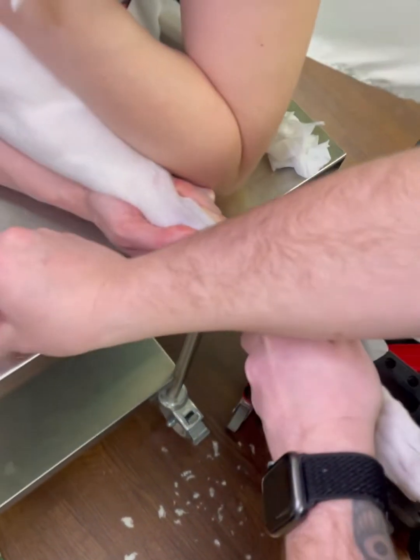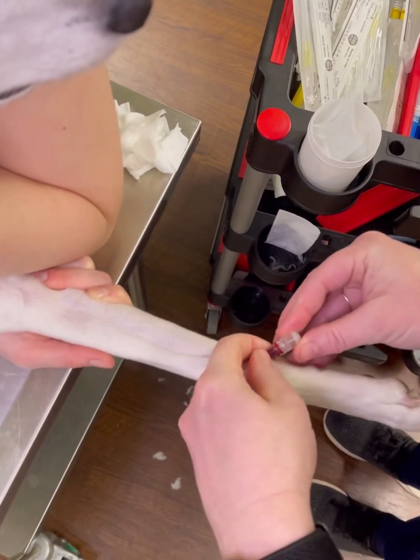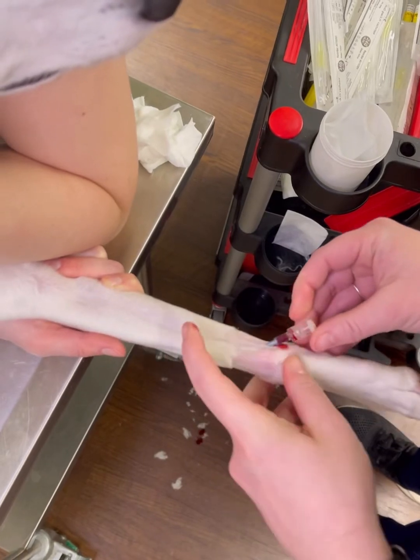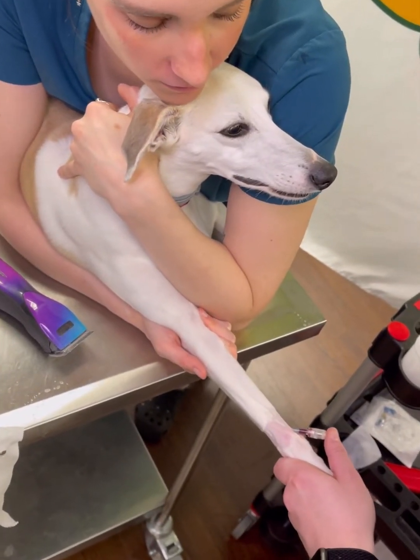Madison's going to let go of the vein. You're going to put your thumb over the catheter and place your cap. Now you have your catheter placed. You want to keep your thumb on the cap.